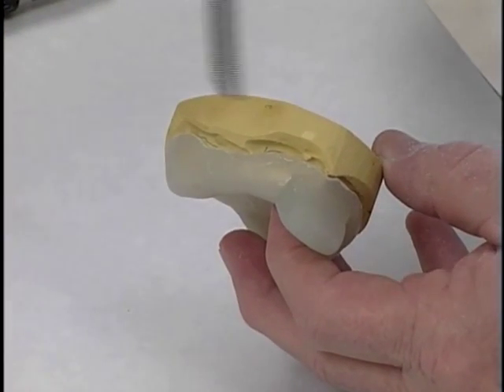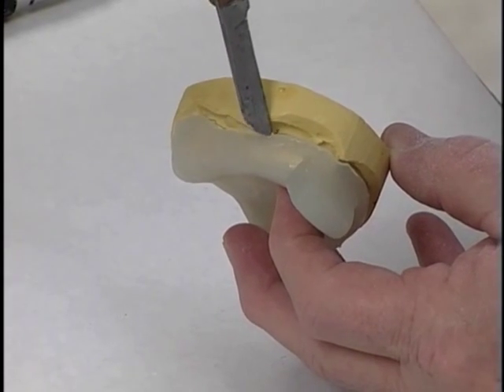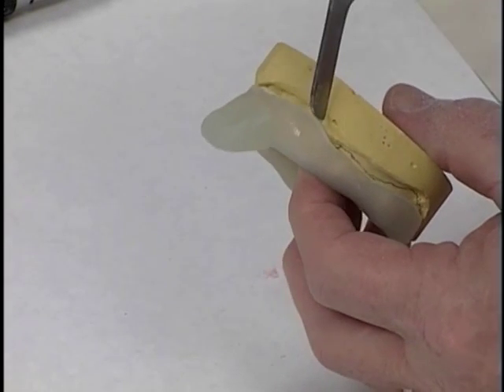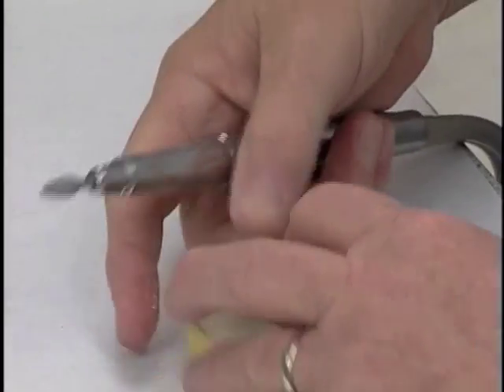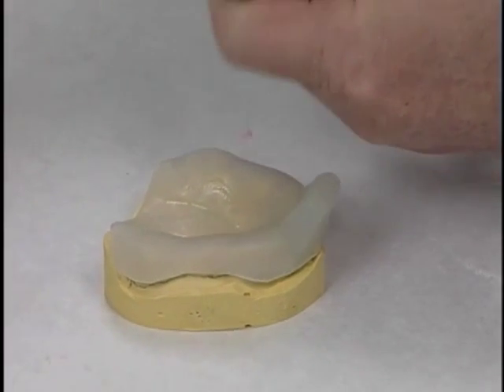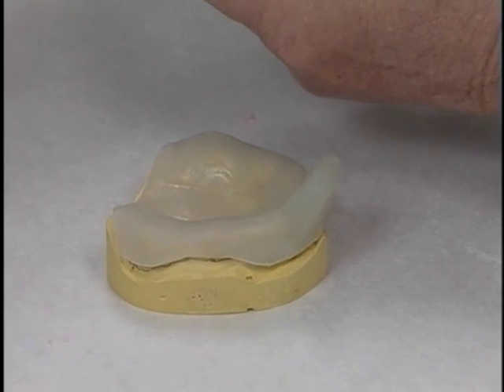And yes, we have an area here where the notch for the buccal frenum needs to be trimmed, the notch for the labial frenum needs to be trimmed, and again the notch for the buccal frenum needs to be trimmed here. Those notches for the frena attachments are best trimmed with a smaller burr than the large one that we were using for smoothing out the peripheries.